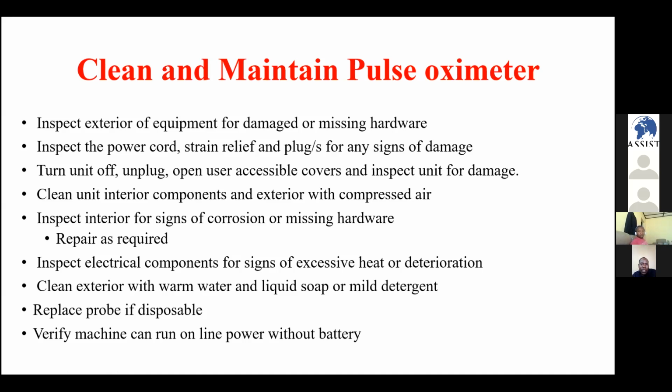So you have to clean the interior and exterior components with compressed air, and inspect the interior for signs of corrosion or missing hardware. If something is missing, you have to call the maintenance team in the hospital to help you manage.